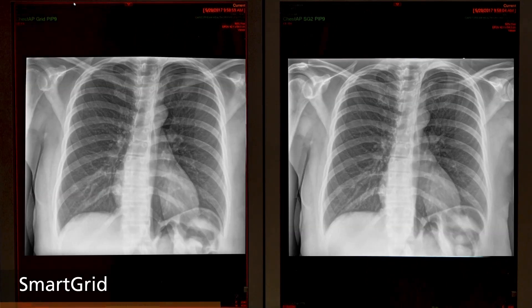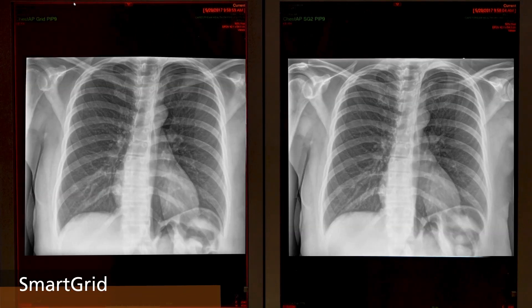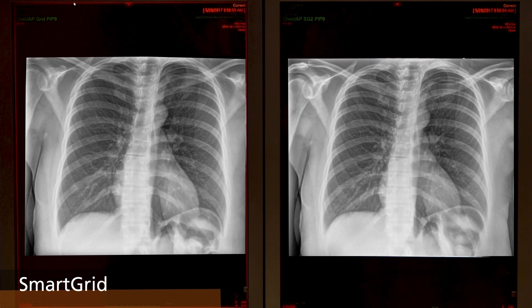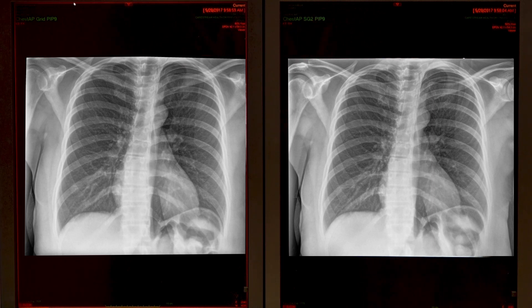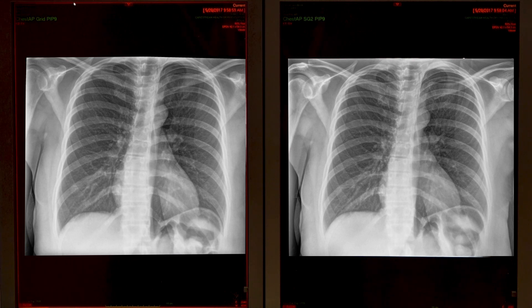SmartGrid suppresses the effect of scatter to improve the anatomical contrast. It provides image quality comparable to images acquired with an anti-scatter grid at a reduced patient dose in bedside chest imaging. On the left is an image acquired with a physical anti-scatter grid, and the same image acquired with SmartGrid on the right. Additionally, SmartGrid can lead to improved workflow and ease of imaging for radiographers.